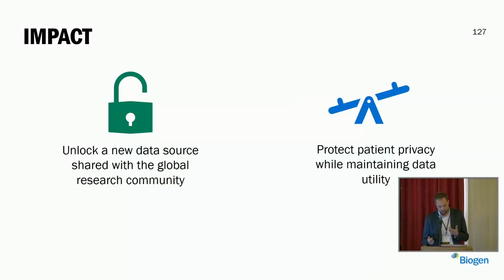So you do all this work and you argue about all these different things, and it's way more complicated than I'm making it sound. You get into patient name. You can't actually get rid of patient name in DICOM. It has to be there, so you have to put something else into it, and what do you put into it? There's all these conversations like that. But at the end of the day, what are we doing?